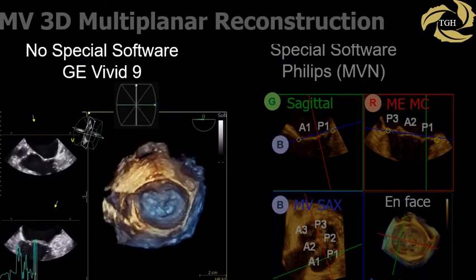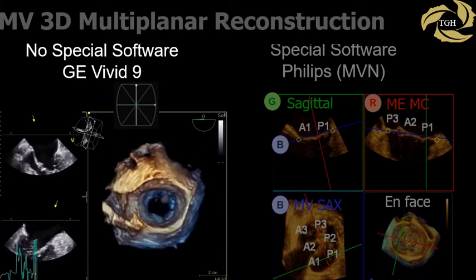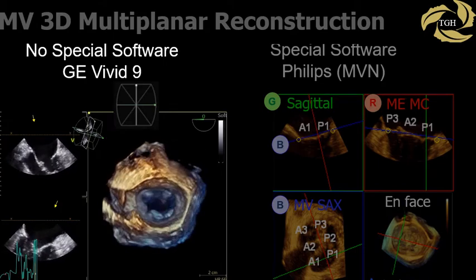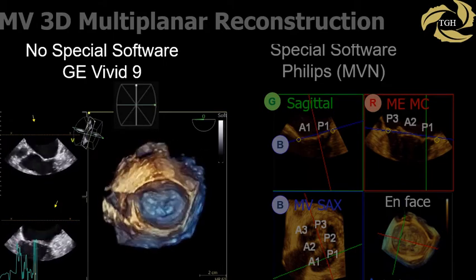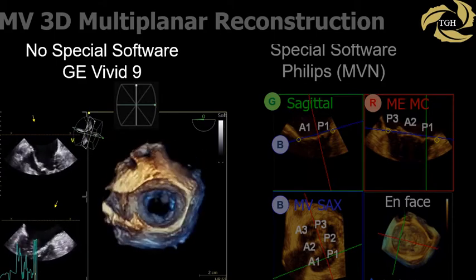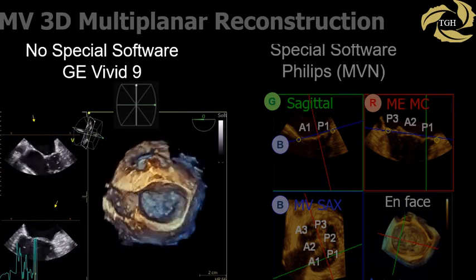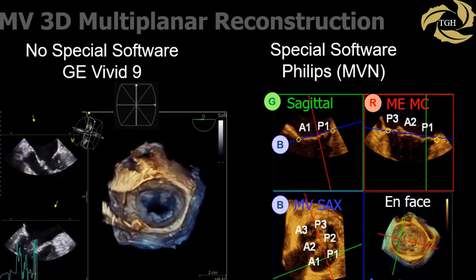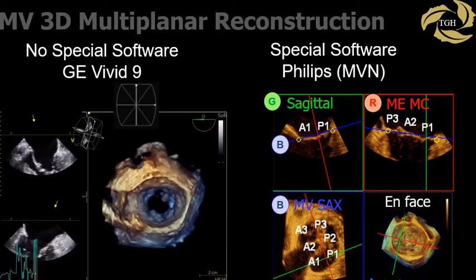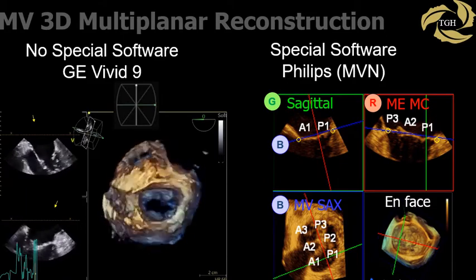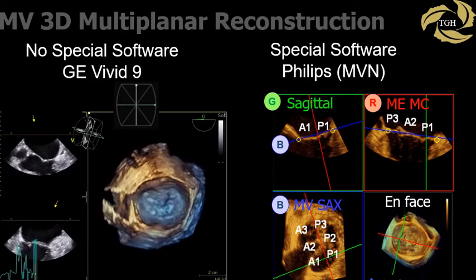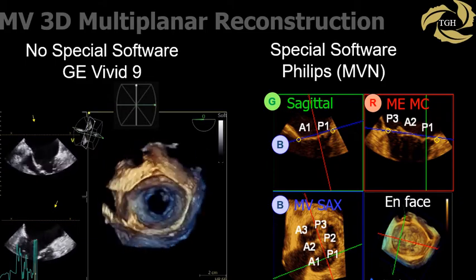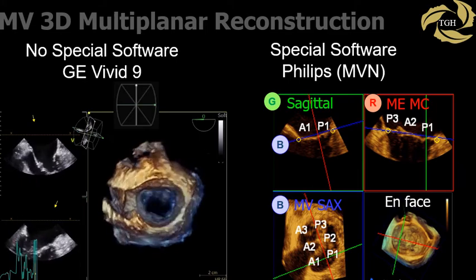Multiplanar reconstruction uses the end-systolic frame of the 3D dataset to look at leaflet motion in relation to the annulus. The workflow varies with each vendor. Options exist to automatically extract four-chamber, mitral commissural, and aortic valve long axis views. Using Philips software, this is done by positioning the blue lines representing the blue plane along the mitral valve annulus in the red and green planes. The blue plane is now the mitral valve short axis view. The red plane is then adjusted to be the mitral valve commissural view by rotating the 3D volume. The green plane can be scrolled along the short axis view to precisely identify individual segments — shown here is A1 and P1.